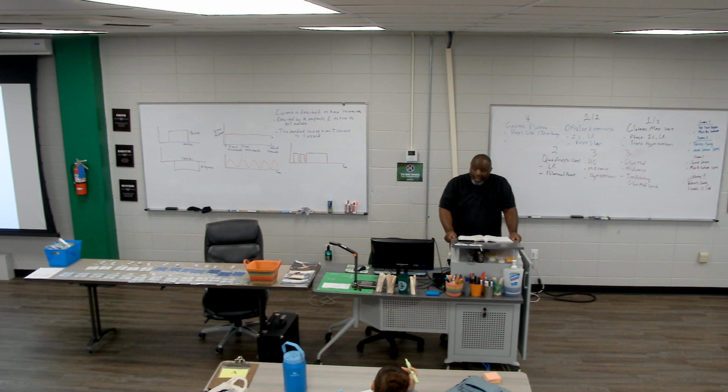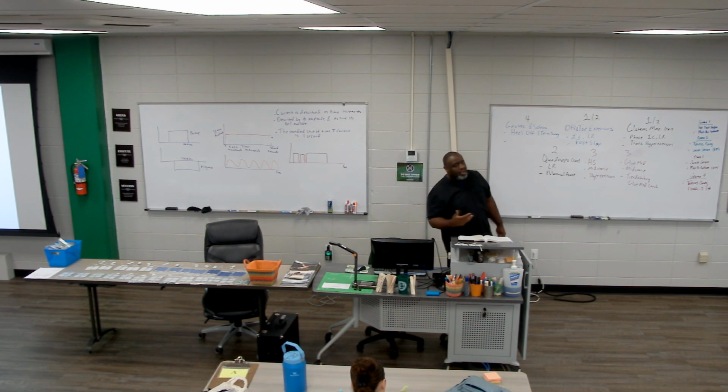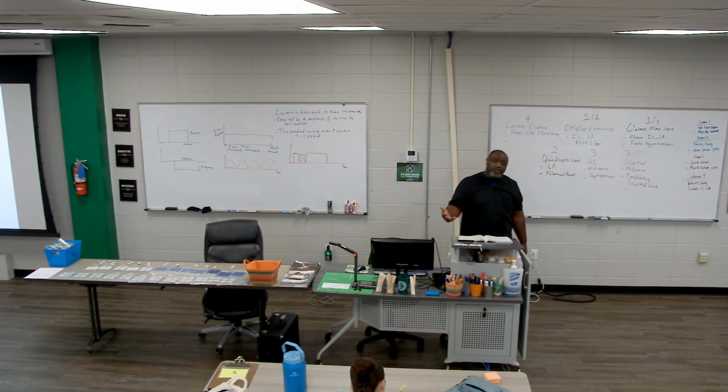So how do I use it? If I'm using it for large muscle groups, I'll use symmetrical biphasic or some other waveform. If I'm doing small, I'll use asymmetrical or some other waveform. Those are my go-to firsts for what I'm trying to do. So large muscles, symmetrical biphasic; small muscles, asymmetrical biphasic.